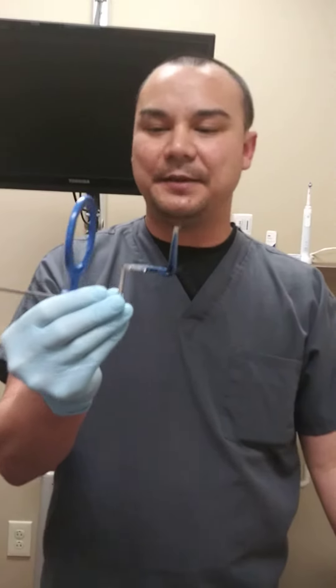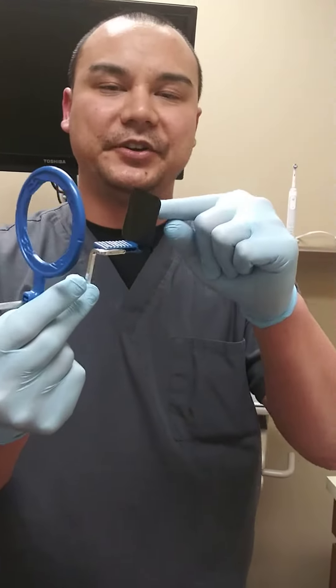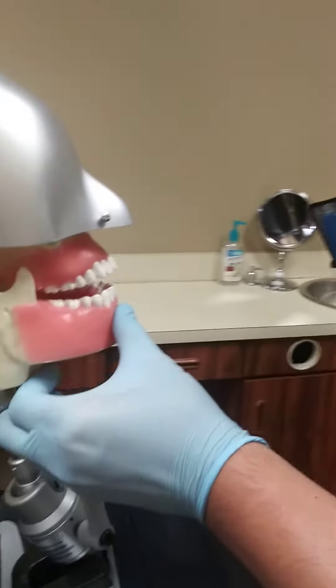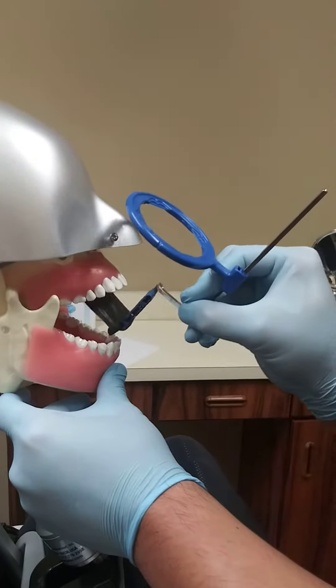So this is a follow-up. Same thing as before, only this time we're using a PSP to take an image. So we'll ask the patient to open. We'll try to take a PA of number 7 once again.